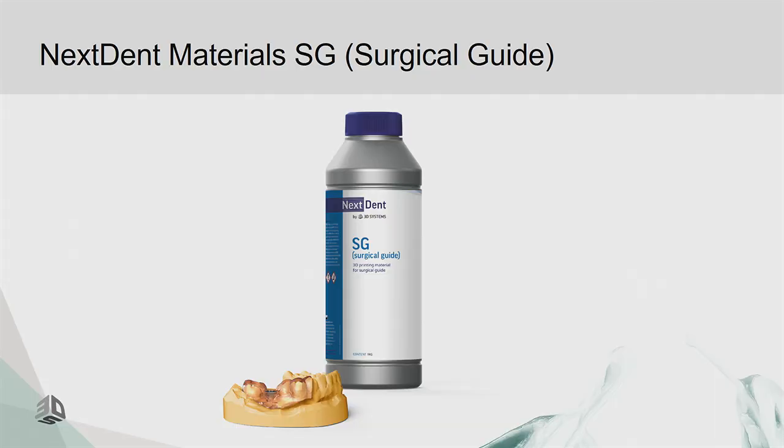Surgical guides, also very popular. Surgical guides, of course, to have the perfect implant positioning. They have been out there for a long time. When I was a dental technician, I used several of them, and I always had to buy them somewhere. And it cost me a lot of money. Now you can print them yourself.